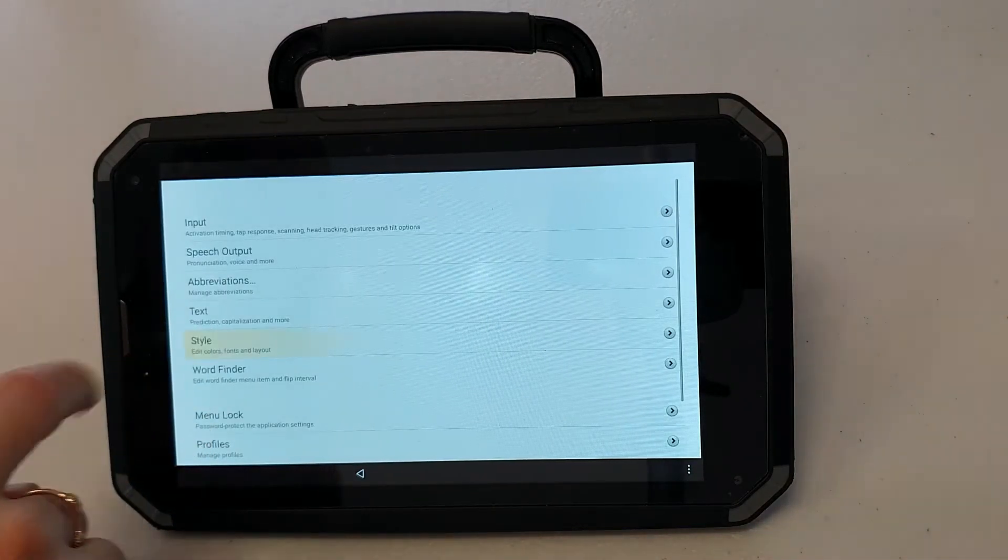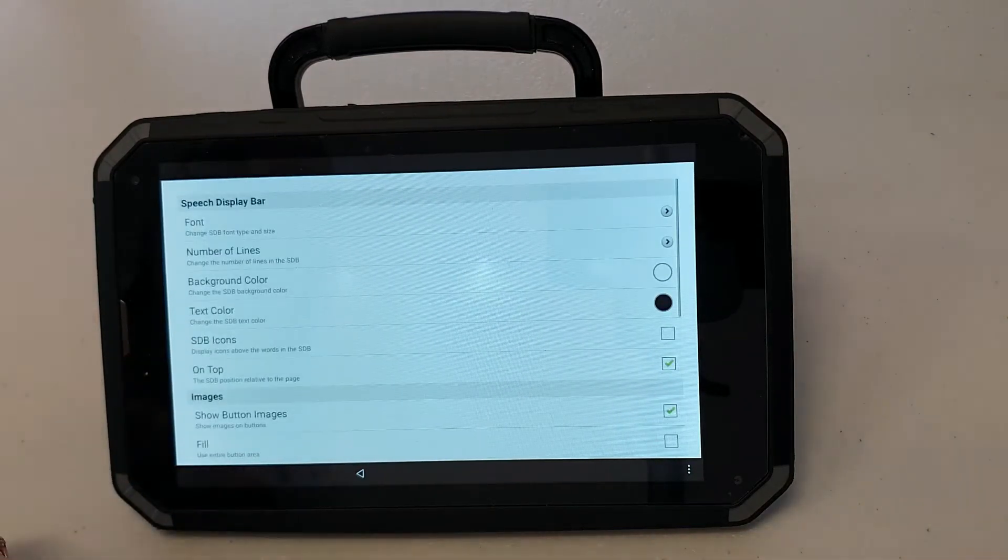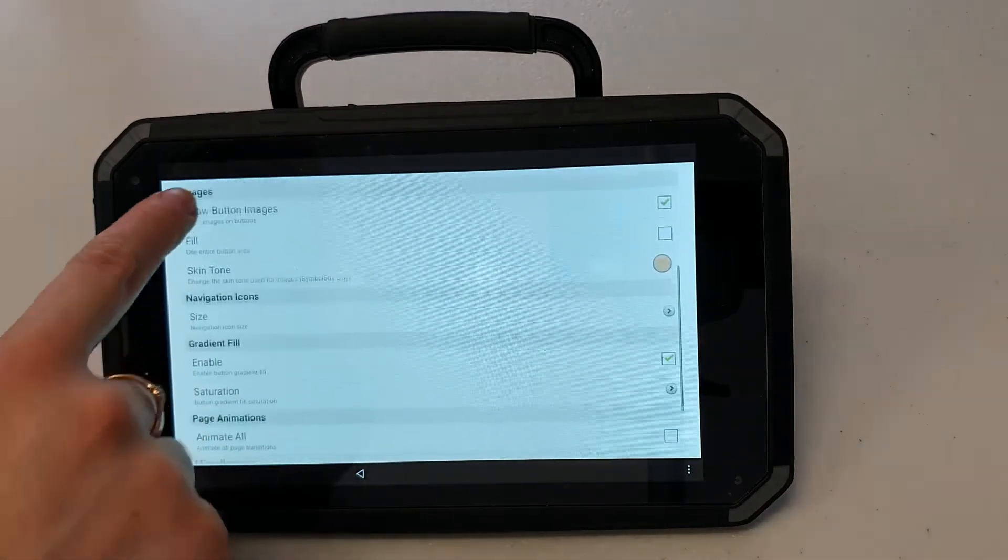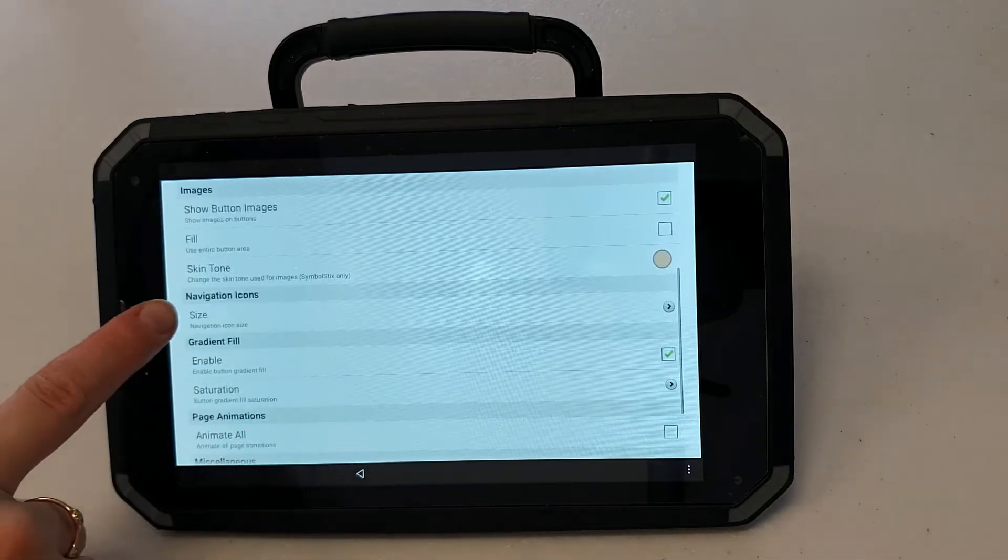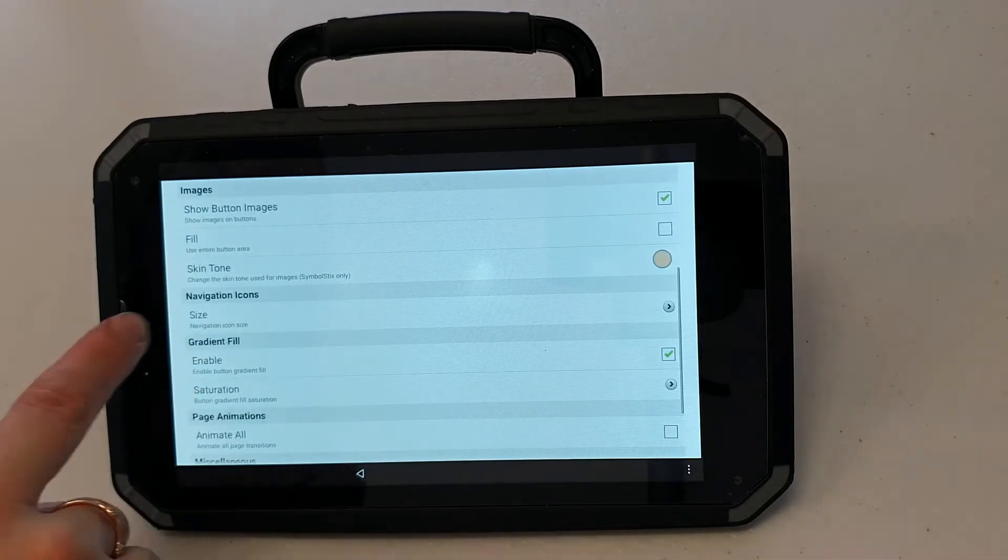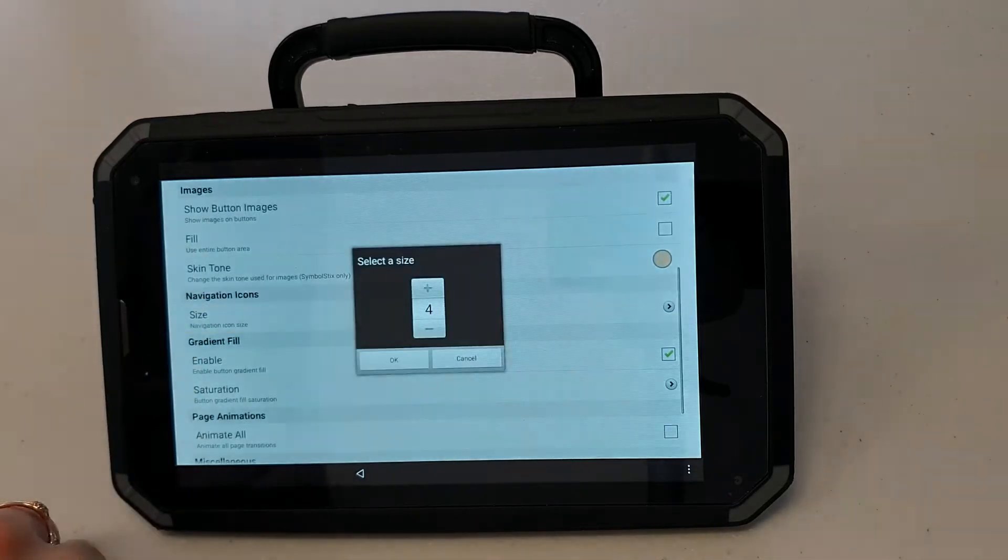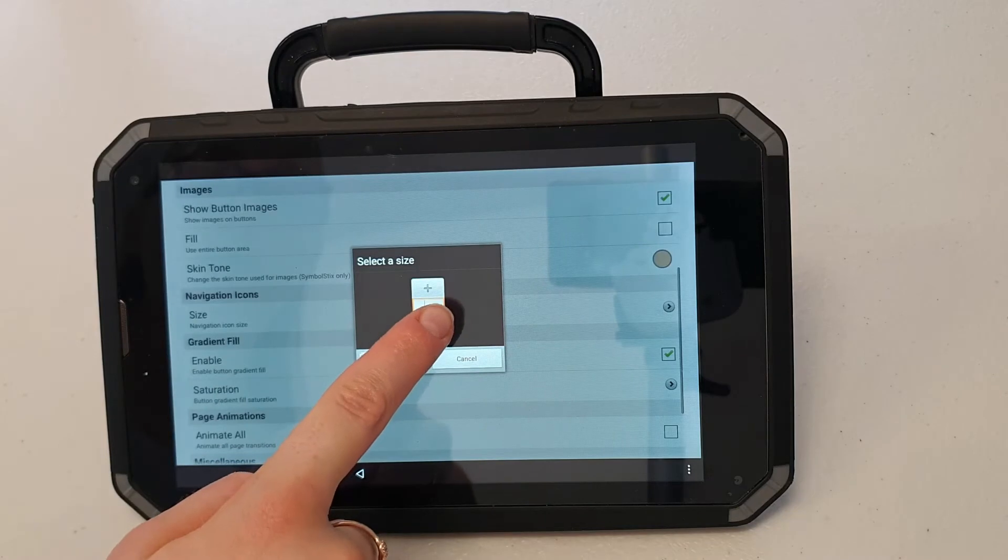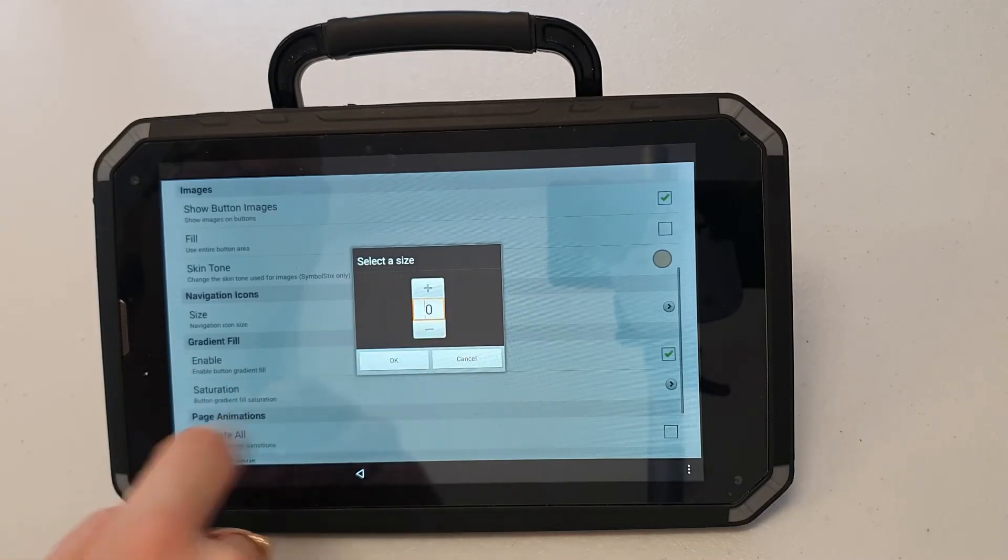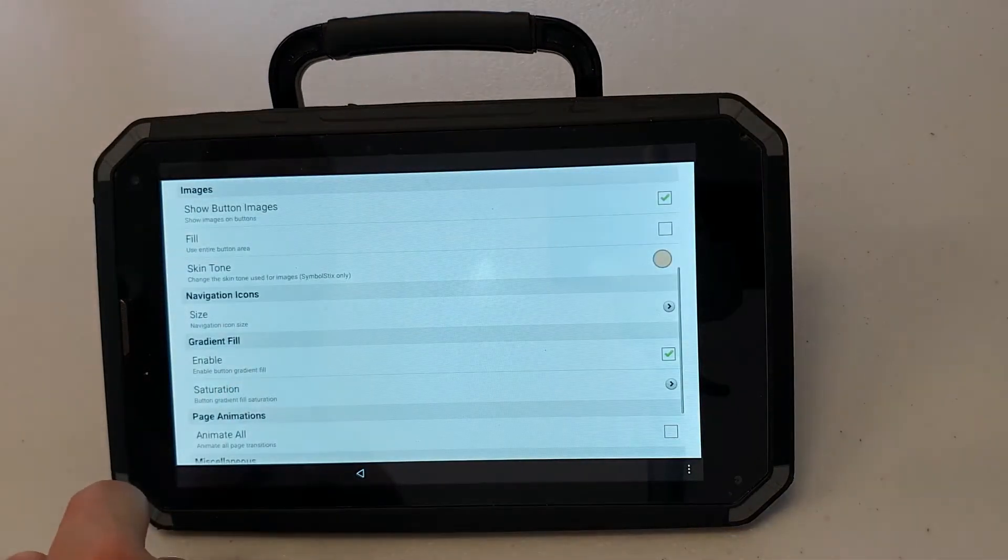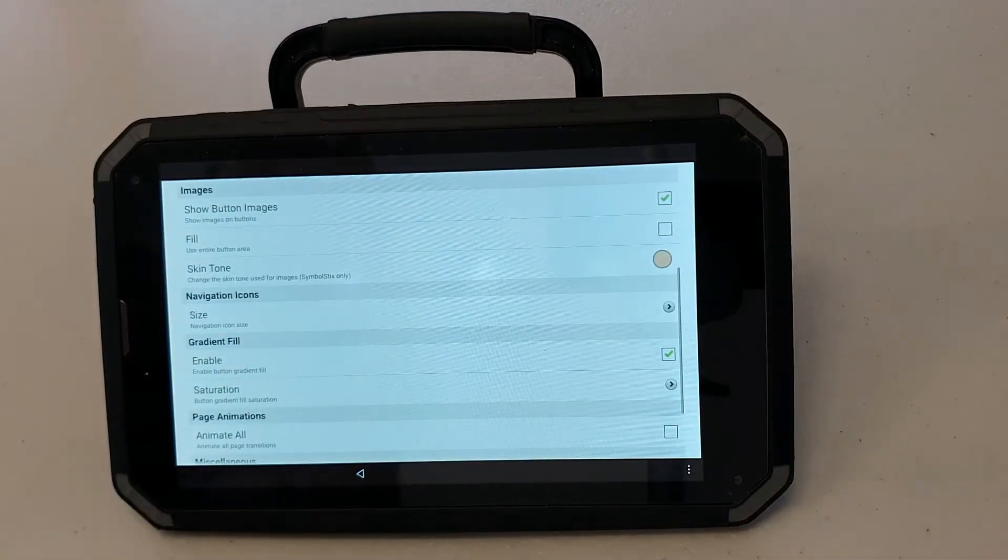I'm going to go to style. After that I'm going to find navigation icons. And I'm going to press the minus button down to zero. So my navigation icons will now be gone.